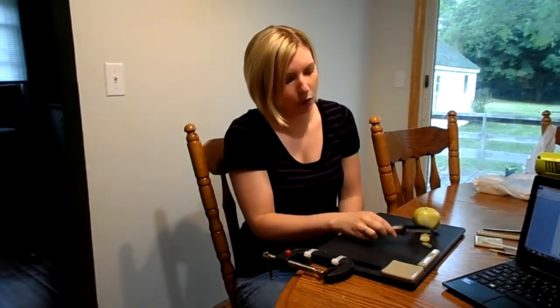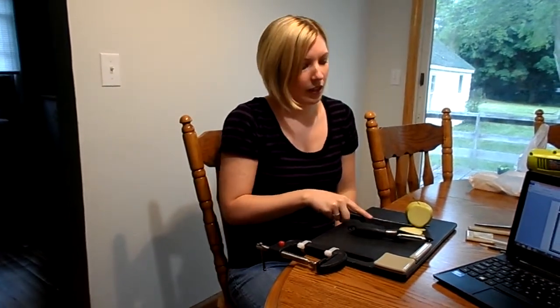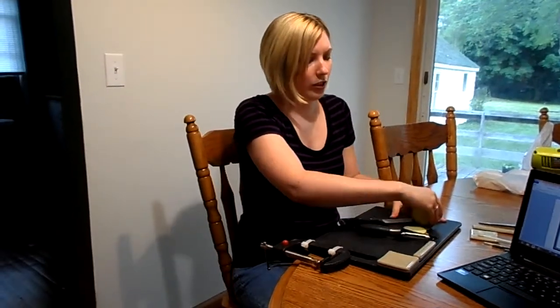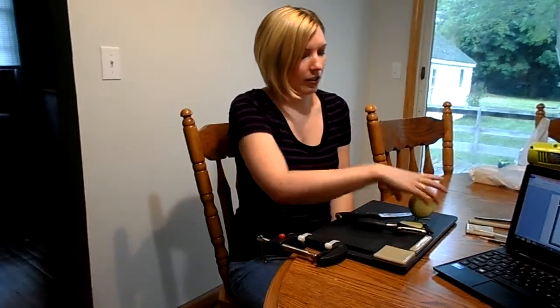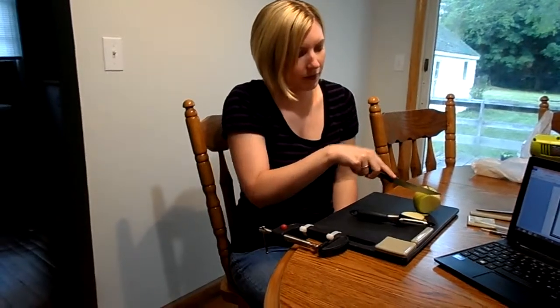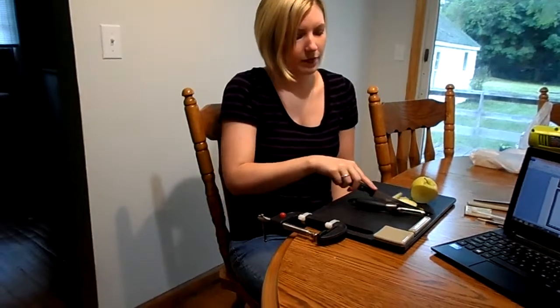And then if I wanted to peel the underside, I could just flip the apple over and peel starting where it hadn't been peeled. And then I could go ahead and slice my apple, just like that. And if I wanted to make more slices, I would move the apple over. Like so, and slice it again. Just like that.